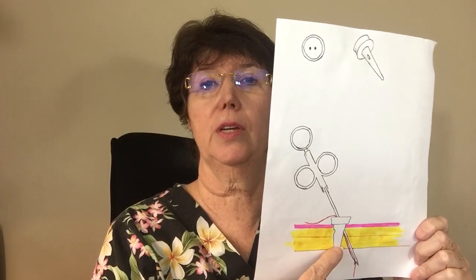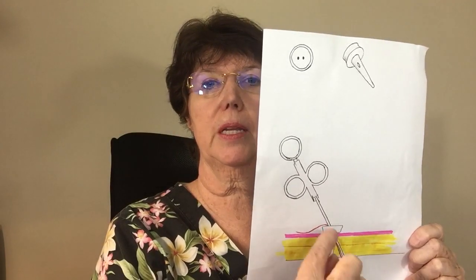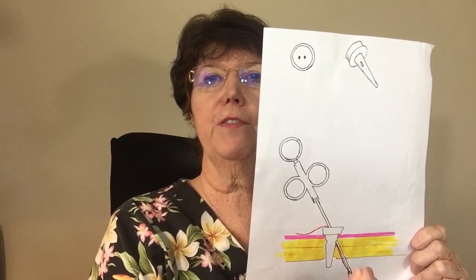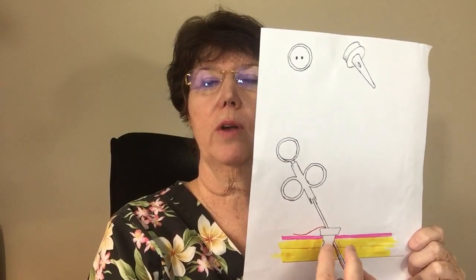Tie the knot as tightly as you can. The surgeon I work with prefers you don't cut the suture until after you've released the indentation. Then take a hemostat through the superficial incision and insert it just under the dermis — about half a centimeter — no deeper than that; you don't want to tunnel or cause bleeding. Lift up aggressively on both sides. You'll feel the trapped tissue release and pop off. Do that on both sides, lifting really high until you feel it release, and then you'll see the skin lay flat without the indentation.